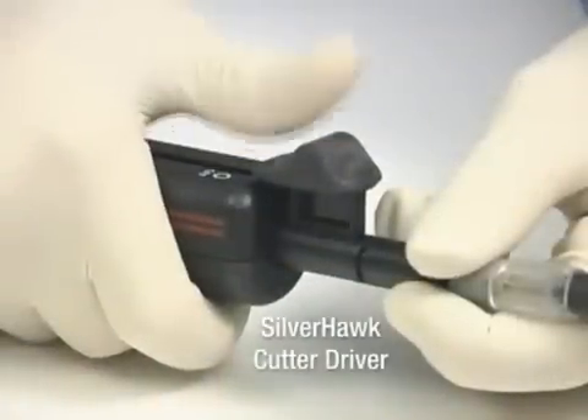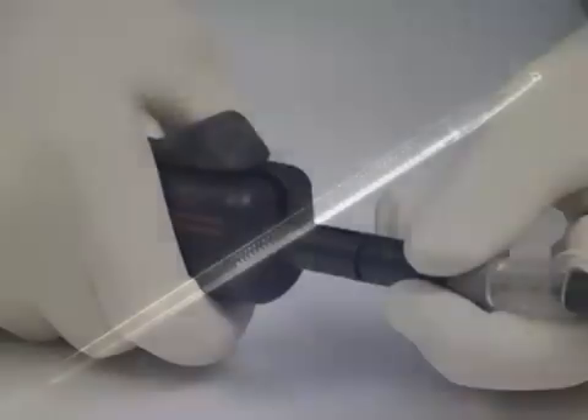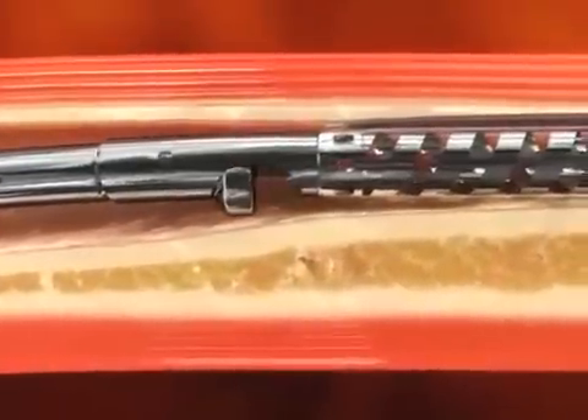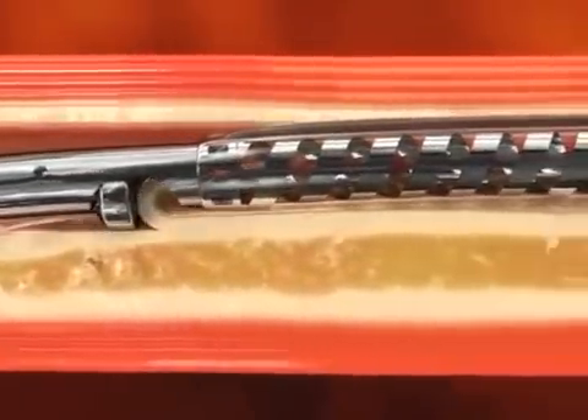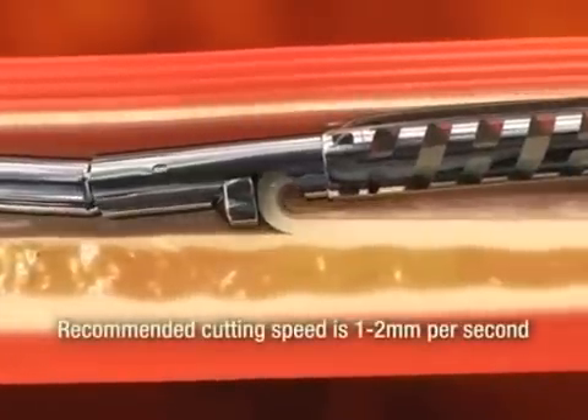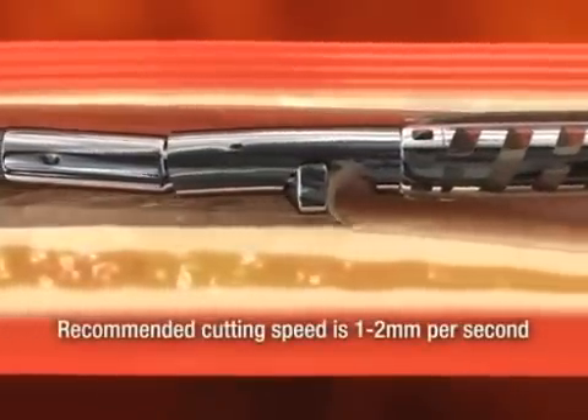To begin plaque excision, retract the cutter positioning lever, which will expose the rotating blade and deflect the catheter tip. Slowly advance the Silverhawk catheter through the target lesion under fluoroscopic guidance. The plaque will be directed into the catheter nose cone.